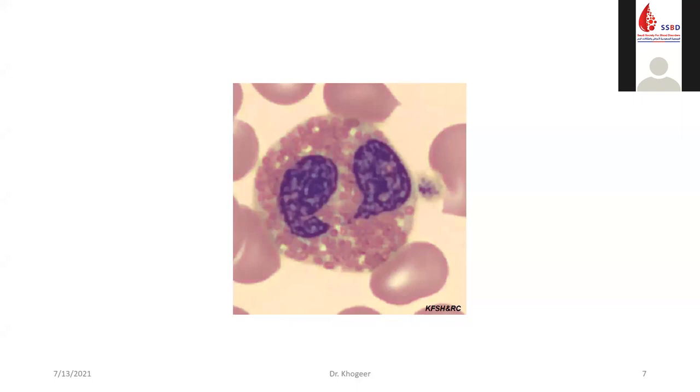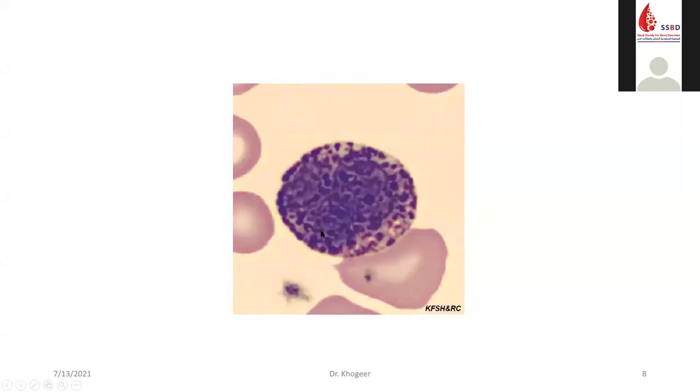Eosinophil is characterized by coarse orange-red granules of uniform size, and is similar to a neutrophil in diameter. Normally, the nucleus demonstrates condensed chromatin and nuclear segmentation with 2 and sometimes 3 nuclear lobes. This is a basophil, which is the least common circulating granulocyte. Unlike the neutrophil, which shows 3 to 5 nuclear lobes, it typically has only 2 prominent nuclear lobes and cytoplasm with numerous dense purple basophilic granules, often obscuring the nuclear details.